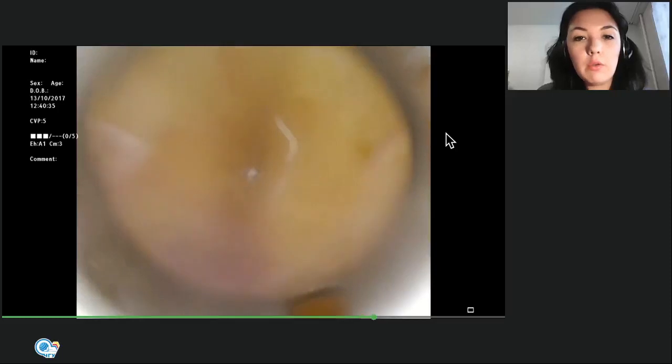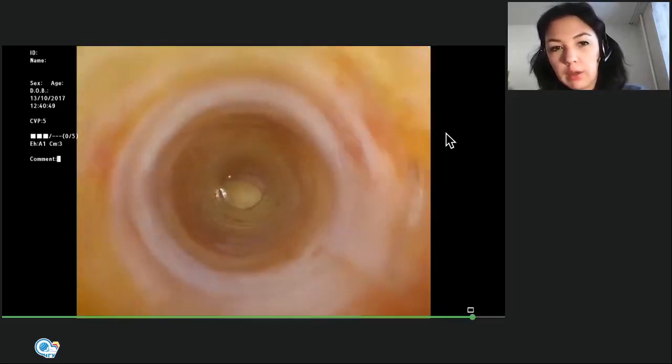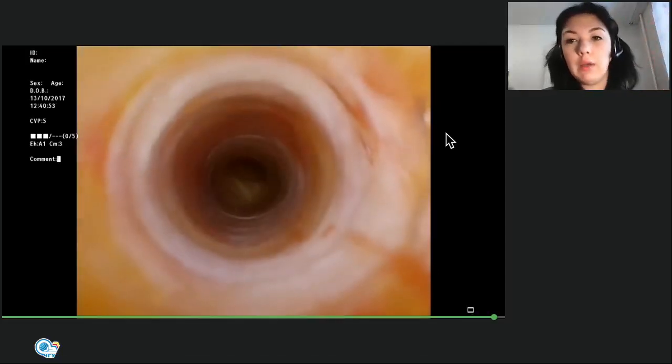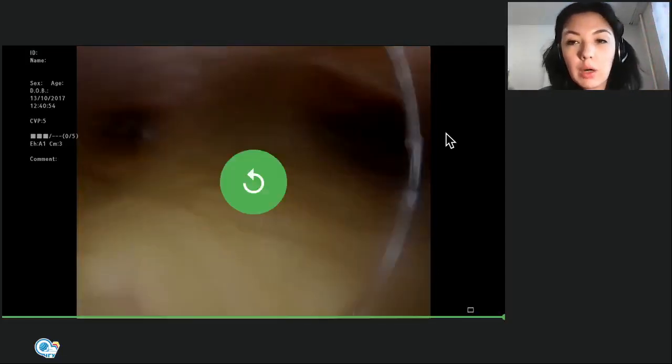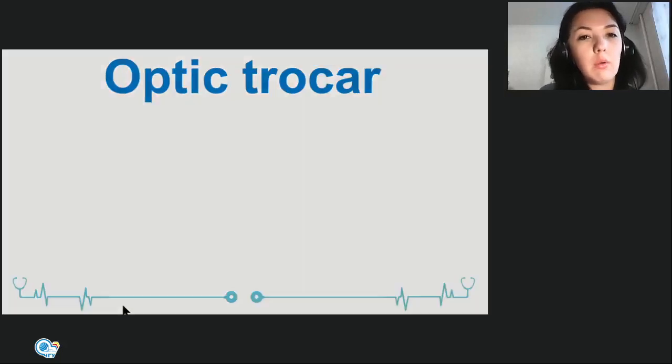And so you see they are different in colors. It's quite easy to distinguish them. And then we saw omental appendages at the very end. So it means, you see it? Yeah, and it means we are inside. So certainly this optic trocar decreases the chances of such complications much, but again, everything has its price, unfortunately, and not all the hospitals in Russia, at least, are still provided with this equipment. But we are trying, we are doing our best.